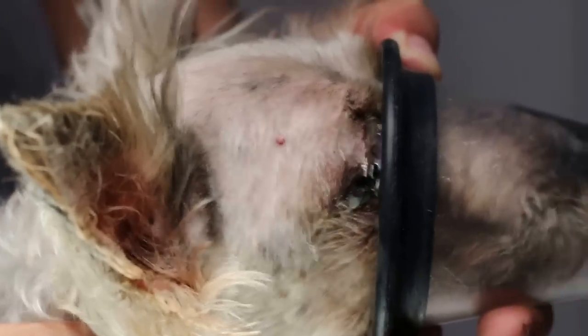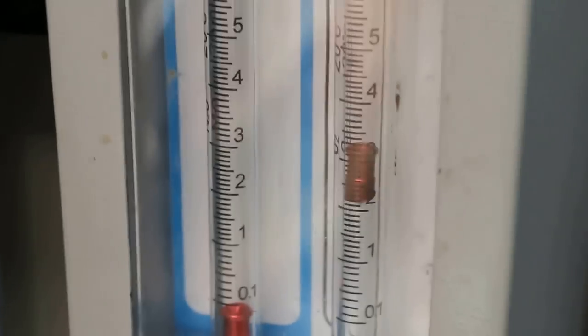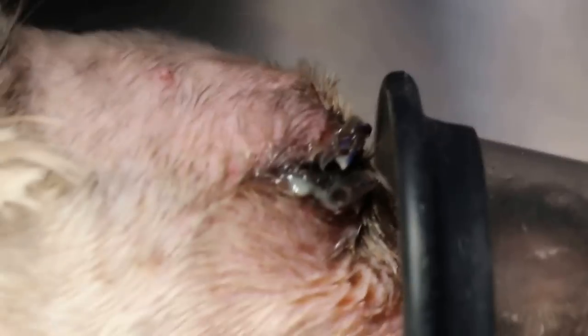So it's a 5% isoflurane plus oxygen anesthesia. Then once the dog is down, you turn to the side. Then the intern will help. Anyway, the dog, move further back a bit. There is some gas there. Further back a bit so that she can help you. Okay. So is it down yet?